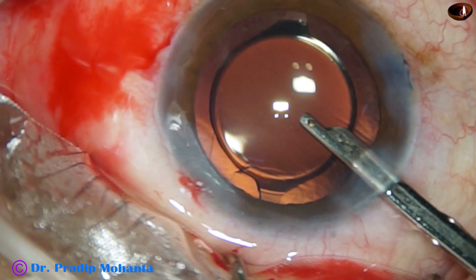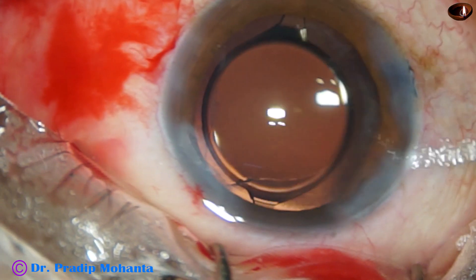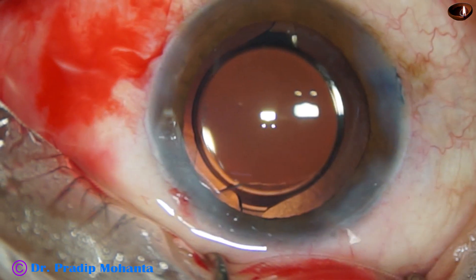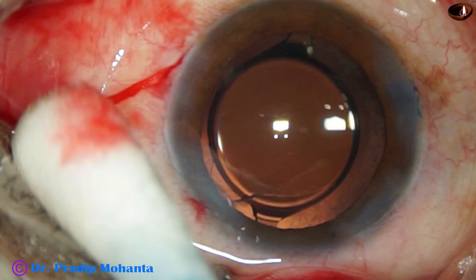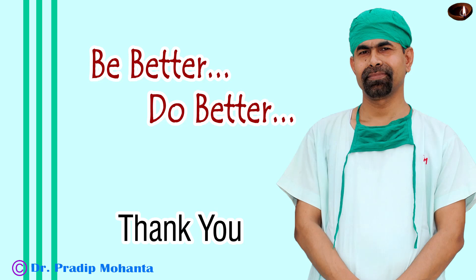We have managed the case well. We must judge the hardness of the nucleus before proceeding with phaco — if it is soft, we can probably proceed; if the nucleus is hard, we should not take any risk, even if the patient is posted for a premium IOL. Please judge your situation very well, listen to your intuition, and always give priority to safety. Think about what is safe for the patient and do accordingly. Thank you very much.